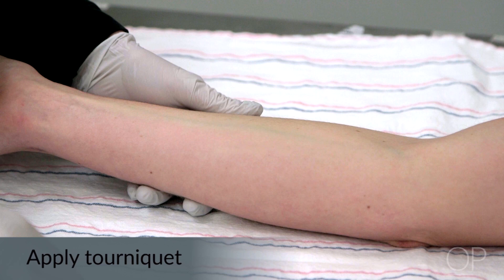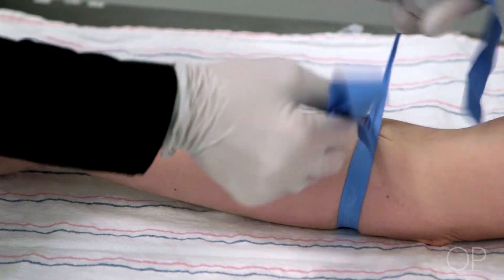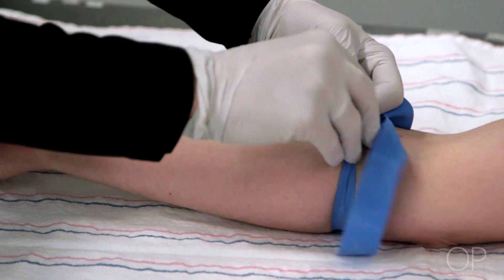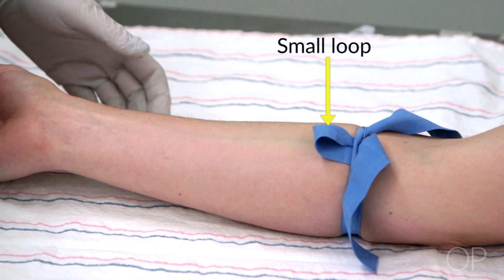Next, you are going to apply the tourniquet. You will loop the tourniquet under the patient's extremity and then pull both tabs upwards. Cross the ends over each other and then pull one tab behind and under the other one. Pull it partially through to create a small loop but do not pull it all the way through. This will leave a tail for easy removal.